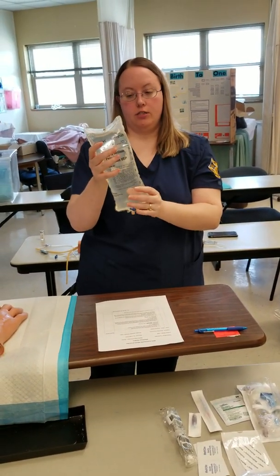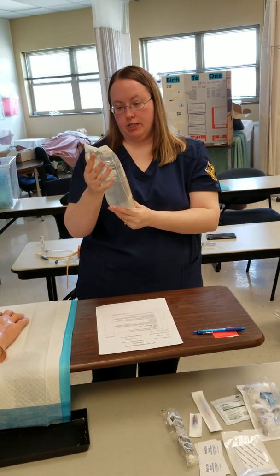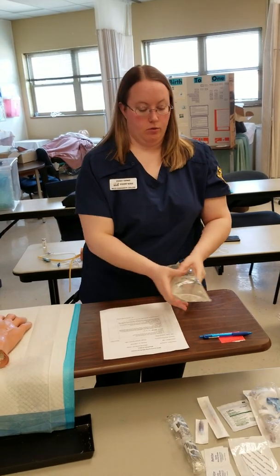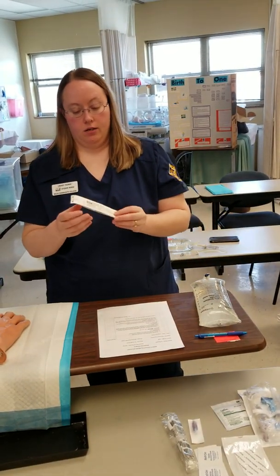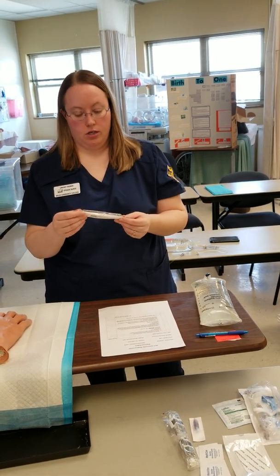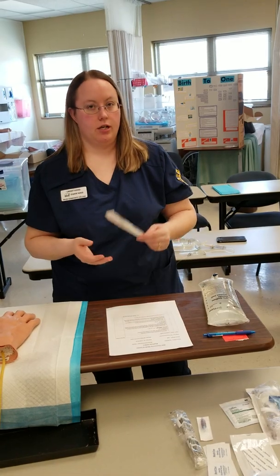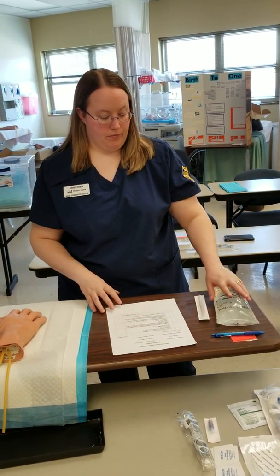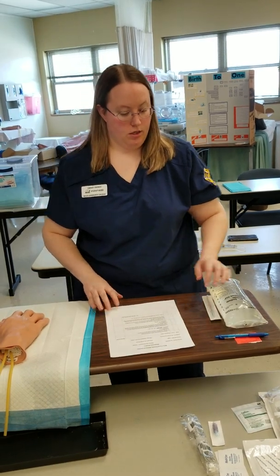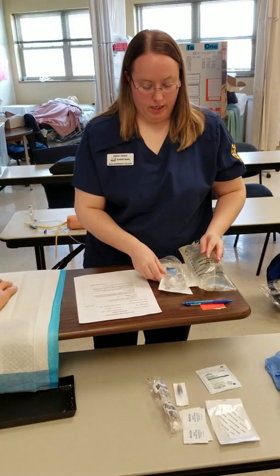there's no particles and no break in the bag. Check the expiration date, and everything looks good with this one. So then I would go ahead and obtain my catheter needle. I would choose the gauge based on the medication that's being administered, the age of the patient, and that information. Would then get my tubing and have all of that ready.